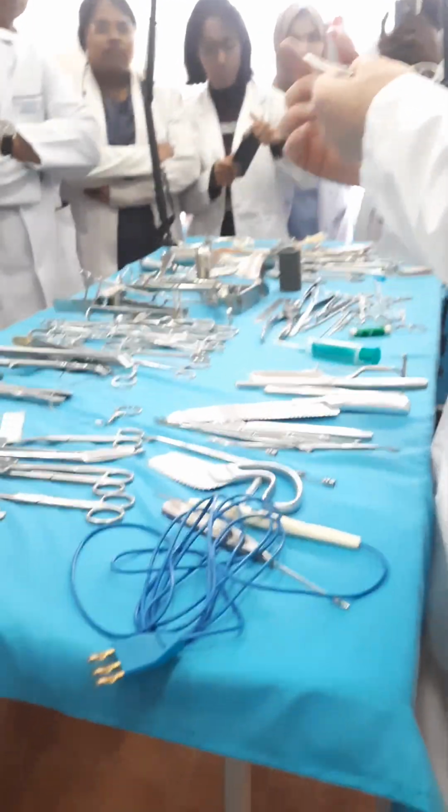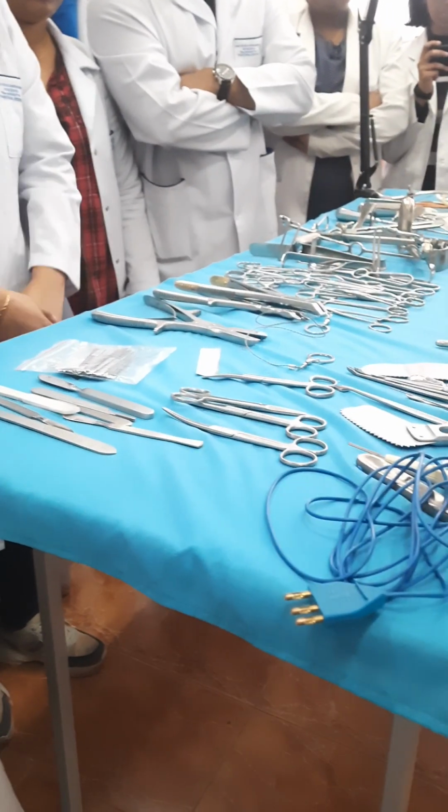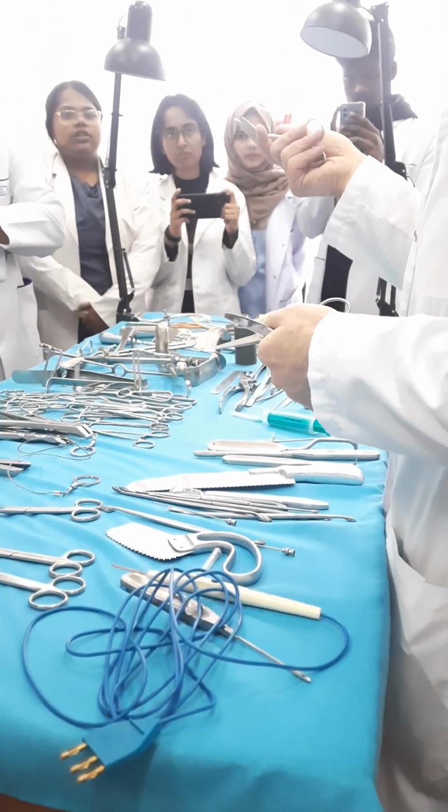Right, for scissors, number one, it is straight. Number two, it is tips. According to the first characteristics, all scissors are divided into these three groups: straight scissors, curved scissors, and angled scissors.